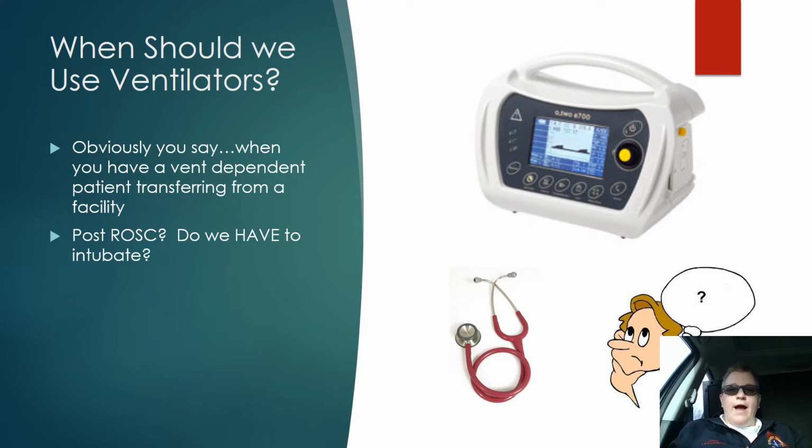If we don't have PEEP on our BVMs, and we really need to get BVMs that have that, or get that little valve to put on a different BVM, every time we ventilate and release, we're de-recruiting, and it takes sometimes a long time to re-recruit the alveoli. So we're not helping our patients in doing that.